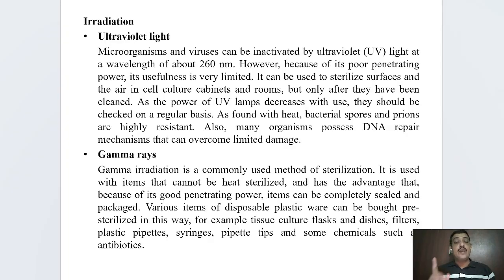One, if we are exposed to it, we can also develop a defect in the skin. So you tend to develop skin cancer, and that is why when ultraviolet light is turned on in a room, you are not supposed to enter the room. And the second disadvantage is it has a poor penetrating ability. That means if you place an object between the ultraviolet ray source and the material that you are going to sterilize, the ultraviolet rays cannot penetrate. So in that way, it has a disadvantage for using it in a cell culture system.